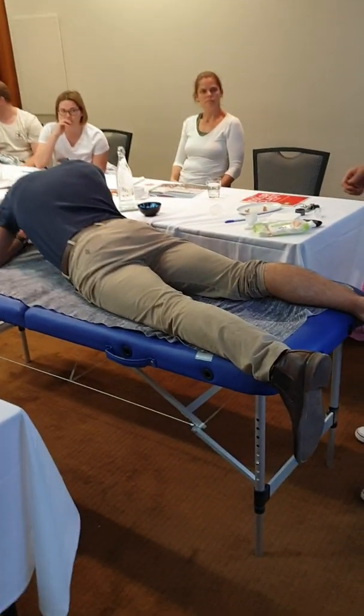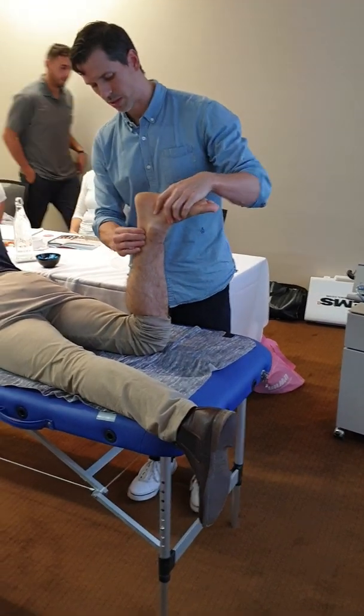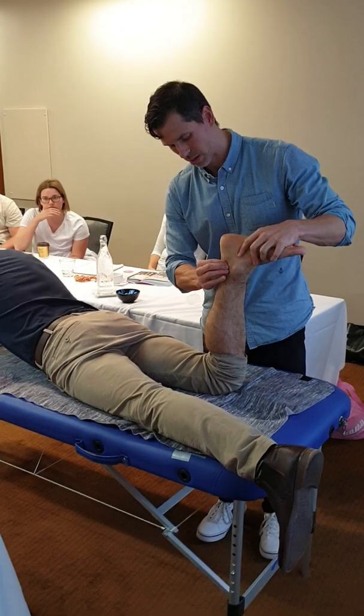About 3, 4 years. You runner? Yep. Mid portion Achilles. Do you still run? Has it got a lump on it, maybe? No, there's no lump. Yeah, I still run.